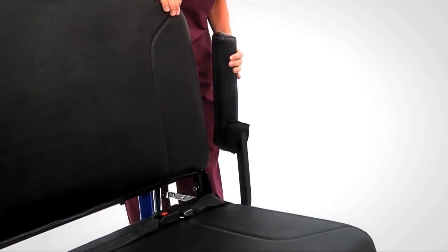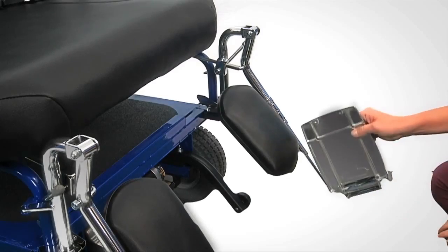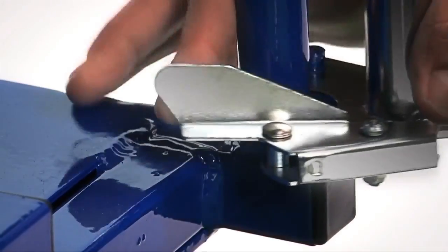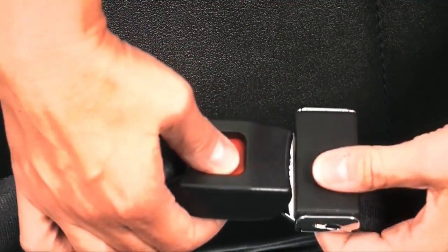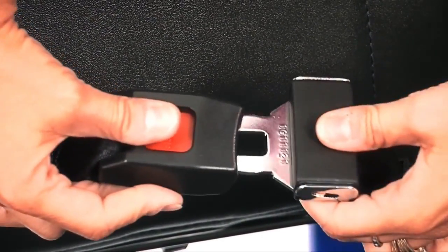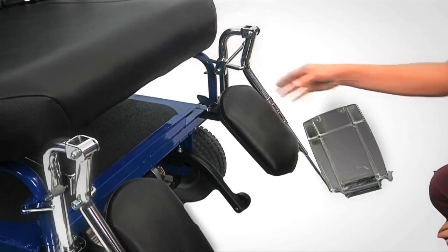When side loading a patient, the armrest can be raised or removed. When front loading a patient, the leg rest can be moved to the side. Once the patient is loaded, an optional seat belt can be adjusted to fit to size.